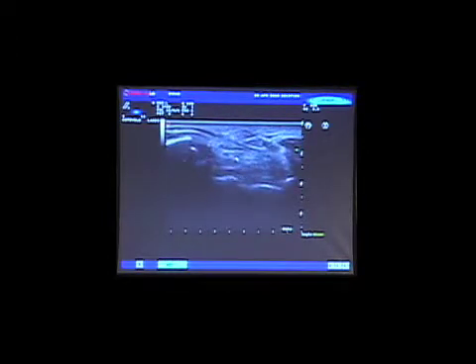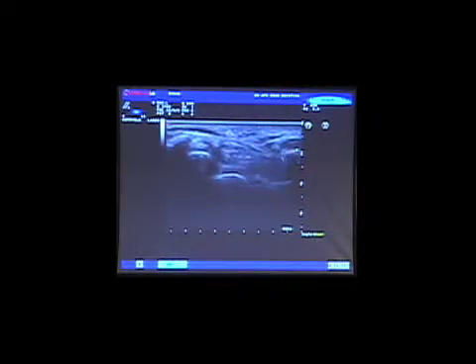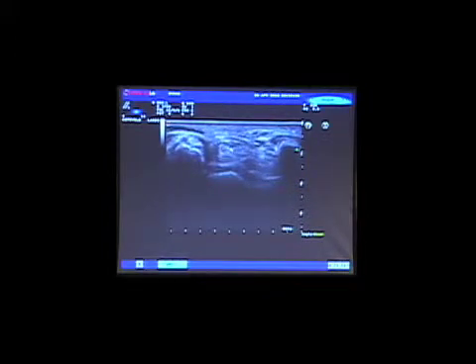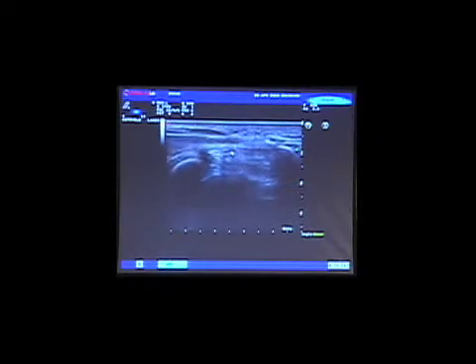More distally, this is the trapezium. The trapezium is flat. This is the typical site of osteophytes in cases of degenerative osteoarthritis of the trapezium metacarpal joint. And on the other side, we see the hook of the hamate. This is the position of the retinaculum, which at the level of the distal tunnel is a little bit thicker, and this is the median nerve. Therefore, remember these 2 levels: distal carpal tunnel, proximal carpal tunnel. And the nerve can be easily recognized as a superficial structure formed by many fascicles.